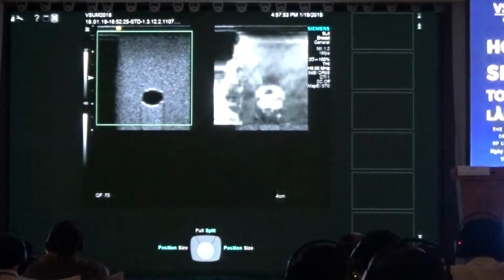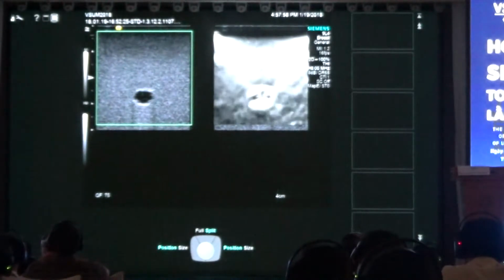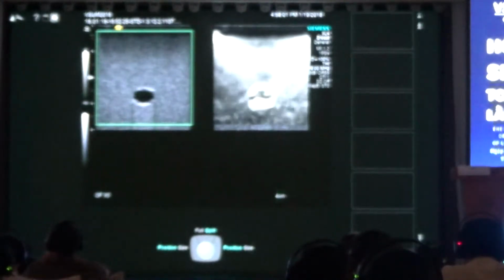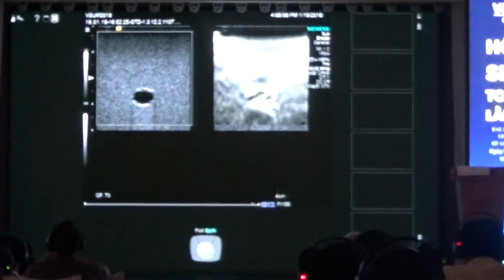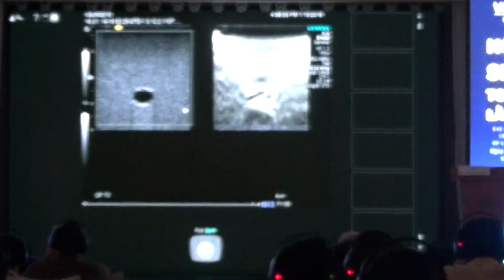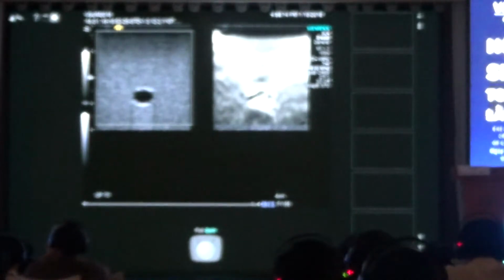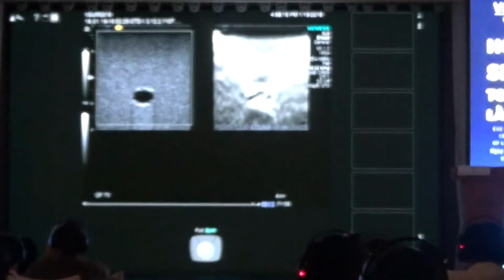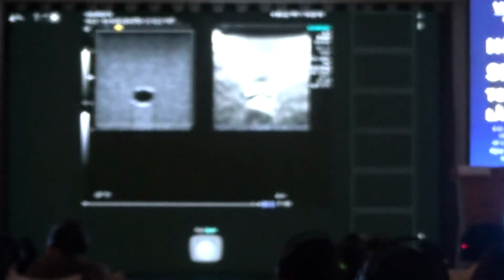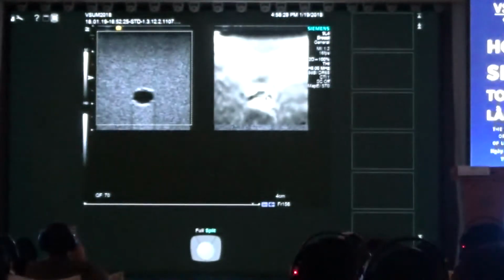Nice bullseye. This isn't the greatest bullseye in the world, but you can see we've got, for this cyst, a black outer rim, a white inner dot, and a white distal dot. This is a very useful examination because, like I said, if we see that this is nice and round, with no abnormality or deformity, we can say that this is a benign lesion.